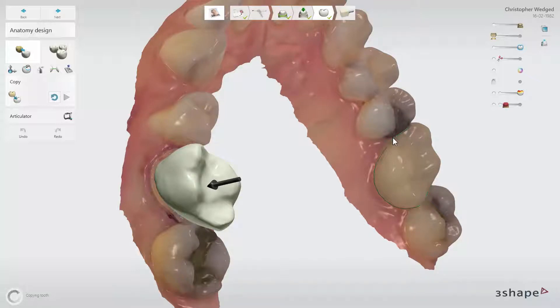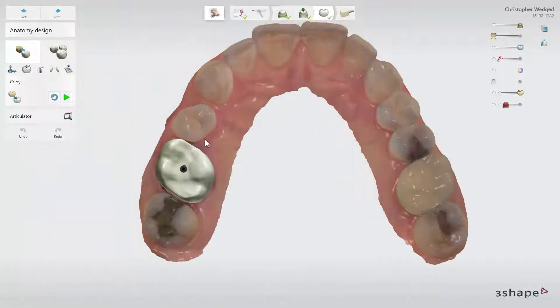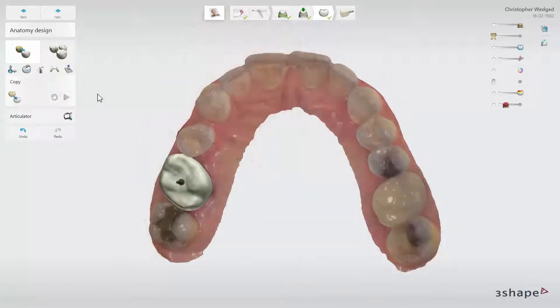You may wish to adjust the line a little. This can be done either by clicking next to it or dragging on the tooth. The software will create a preview of the tooth that can be copied. After any adjustments have been made, click the green arrow to copy the tooth. You can then proceed to use the other anatomy design tools to adjust contact points and occlusion if needed, before moving on to the CAM module.